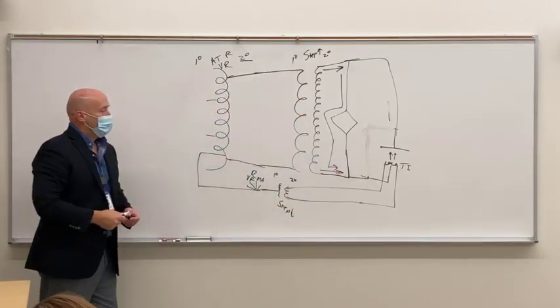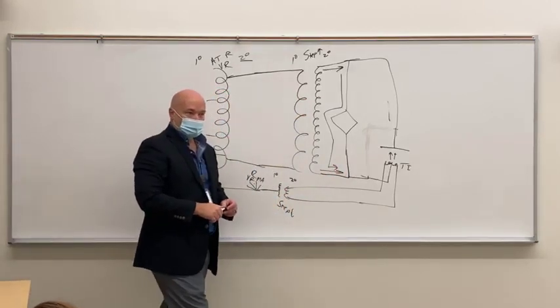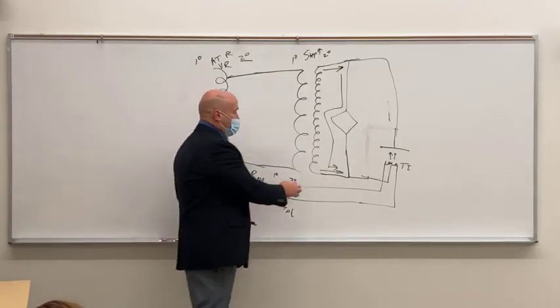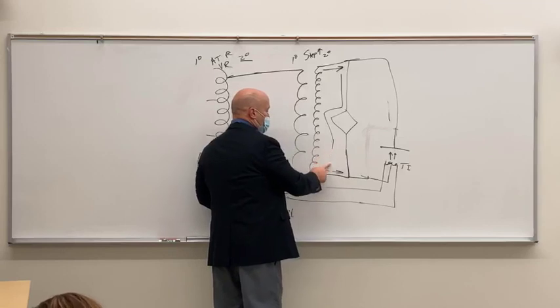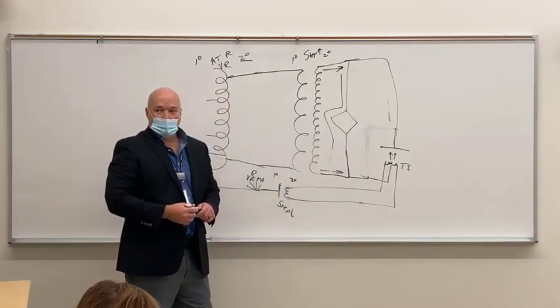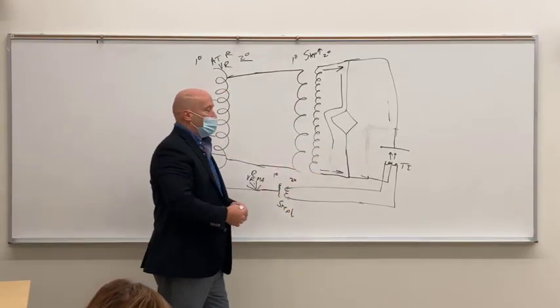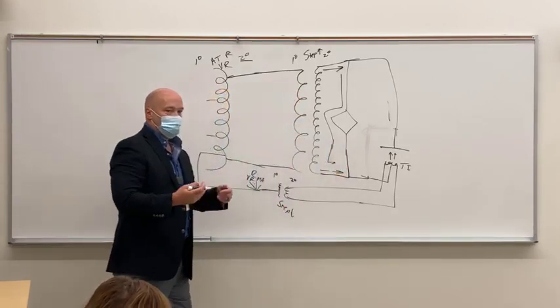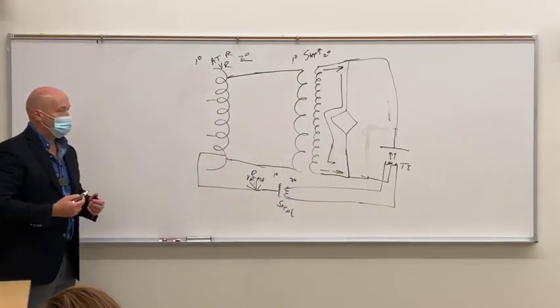All right, so what do we have at that point? Direct current. It's pulsating direct current. Even if we didn't do this, would we have direct current? Yeah, because it's only going in one direction, but by adding it, we double the output of the X-ray tube and make X-ray creation a little more efficient.